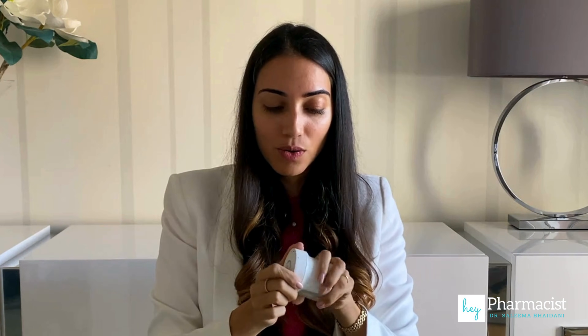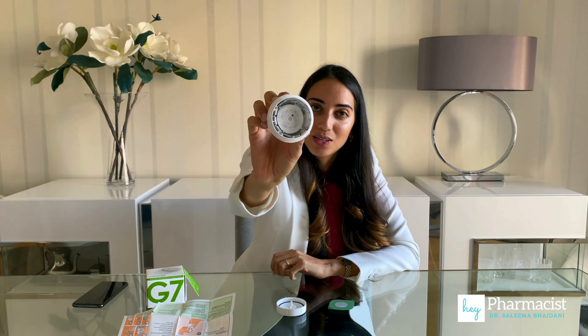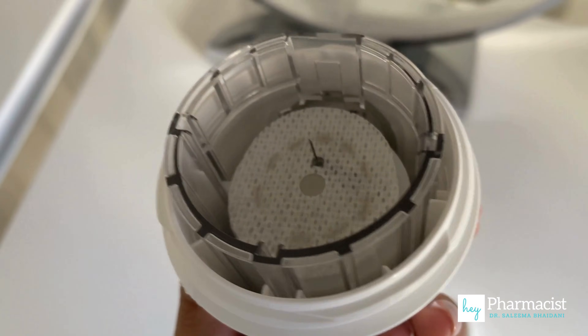I'm going to go ahead and open this so we can see what that looks like inside. There is a seal here, so I'm going to break that seal. It also has a needle inside, which helps with the placement of the filament into the patient's skin.